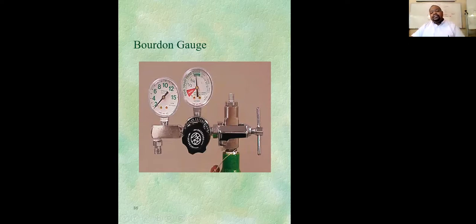Now, if we look at this, what safety systems do we see? The first safety system is color. We see this is a green cylinder, so it's an oxygen cylinder, right? And oxygen cylinders use the PISS, the pin index safety system. So we know oxygen is 2 and 5, right? So this regulator will fit over those pinholes on the E cylinder, and then the yoke will turn and get it tight. It's the yoke and pin. The PISS uses the yoke and pin connection. Then we would turn the actual cylinder on, and that's when our pressure will read, right? Boop, right to the pressure. Then we would turn on the flow that we want, okay?